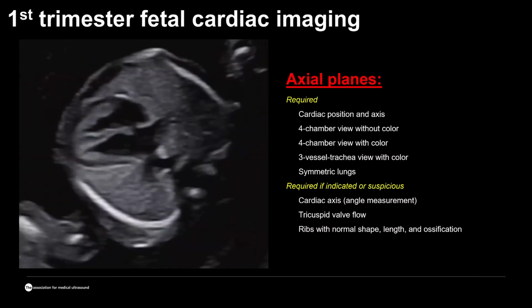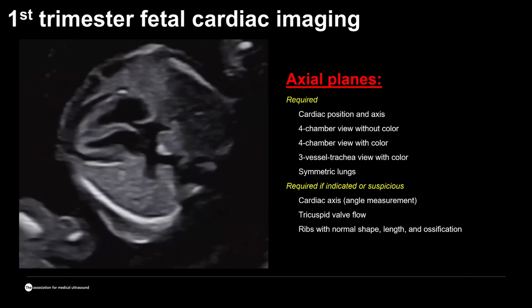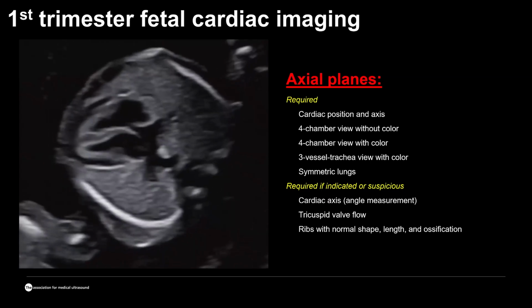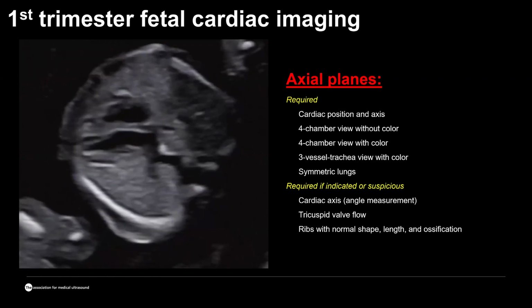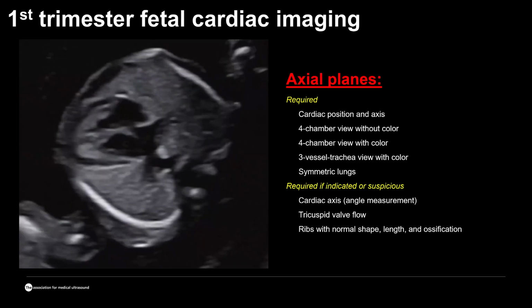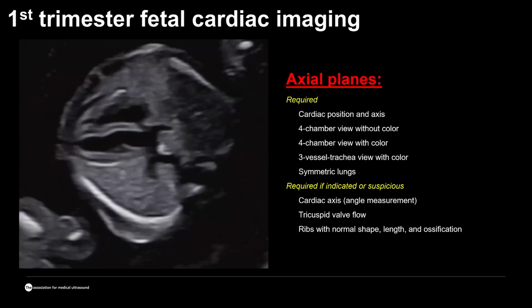My talk would not be complete if I did not mention first trimester cardiac imaging and the new developments in our probes, and how the resolution of the transabdominal probes improved dramatically. Here is the quote from the AIUM guidelines. This is the detailed ultrasound in the first trimester between 12 and 14 weeks gestation.